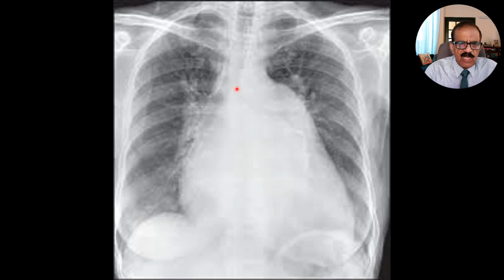Now, if you see the trachea, I think this is a very interesting finding, and if this is the trachea, and this is the left main bronchus. Now, if you agree, this is also somewhat lifted. Normally, the left bronchus should come like this. It is somewhat lifted, and this is again a sign of left atrial enlargement. The left atrium is situated here on the back side, and that has lifted up the bronchus. So this typical shape is mitralization, very typical of mitral valve disease.